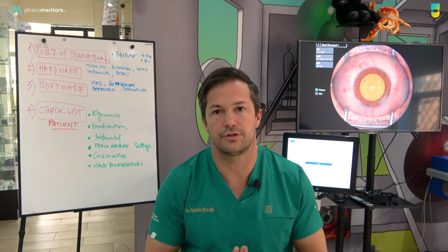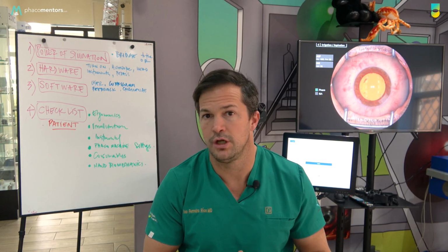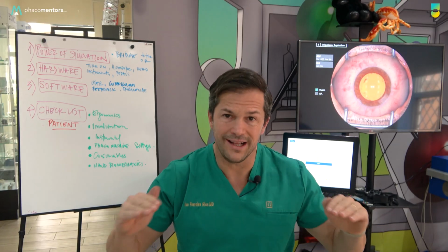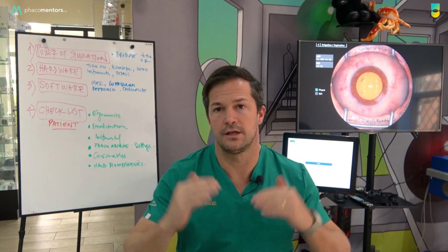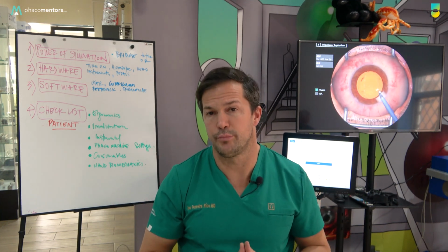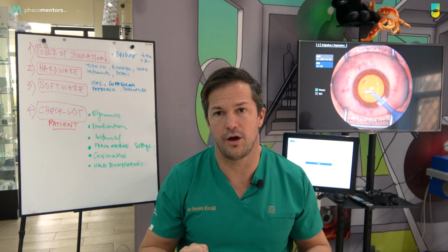I'm one of the mentors around the world who dedicates his life to teach surgeons, no matter at what stage you are, to raise your level to the next level. It's important that you understand the machine, then you can take the most out of it.